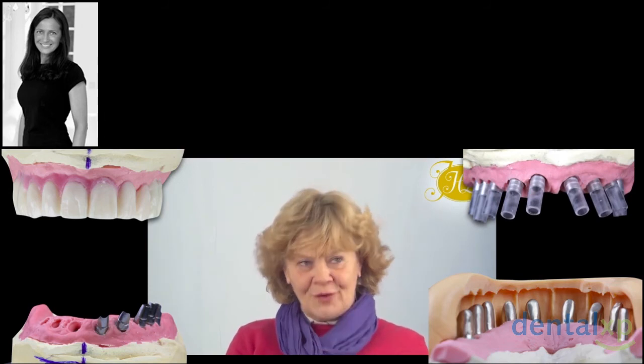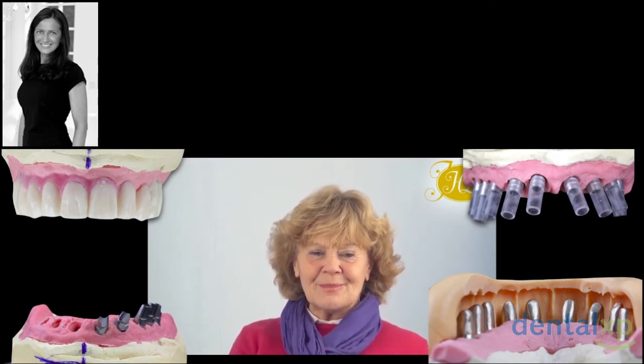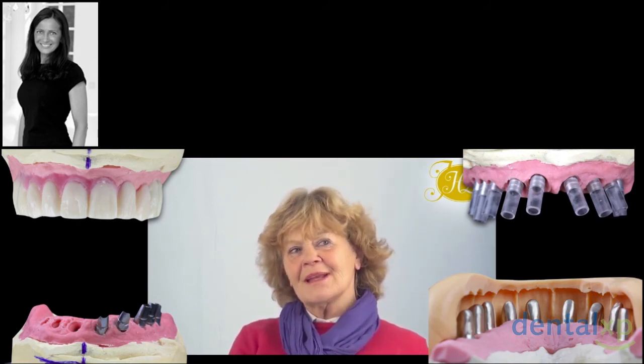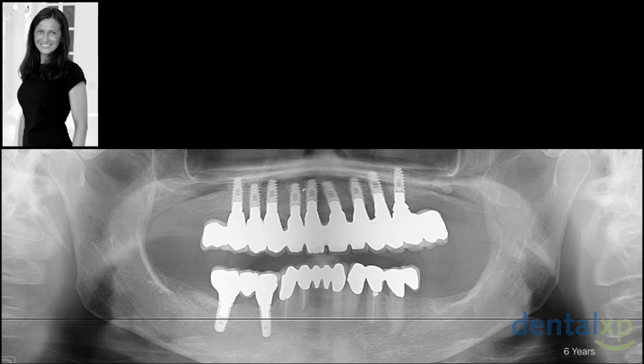Impression taking, and when we need a pin component, the first thing is an aesthetic try-in, and that will be the basis for a backward planning of the abutment that you choose and of the frame. So this is the work. It can be screw retained or can also be cemented if the patient can clean, if the technician is constructing it appropriately. And this is after 6 years. Okay?